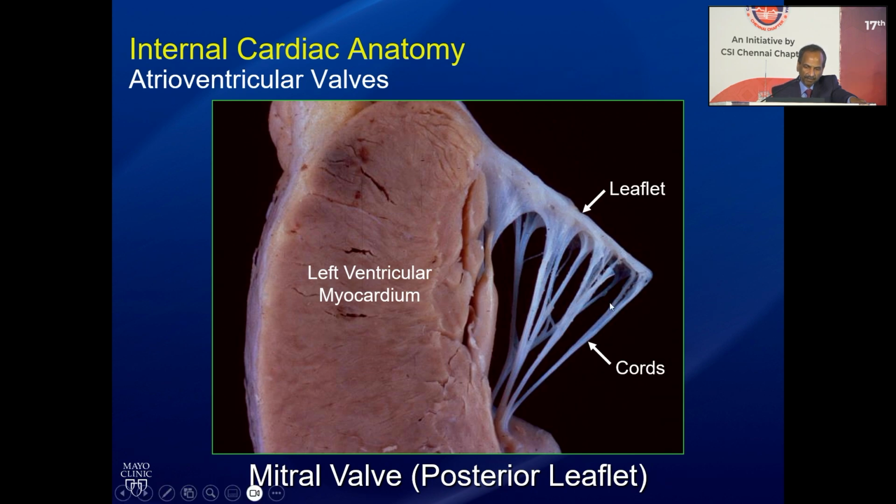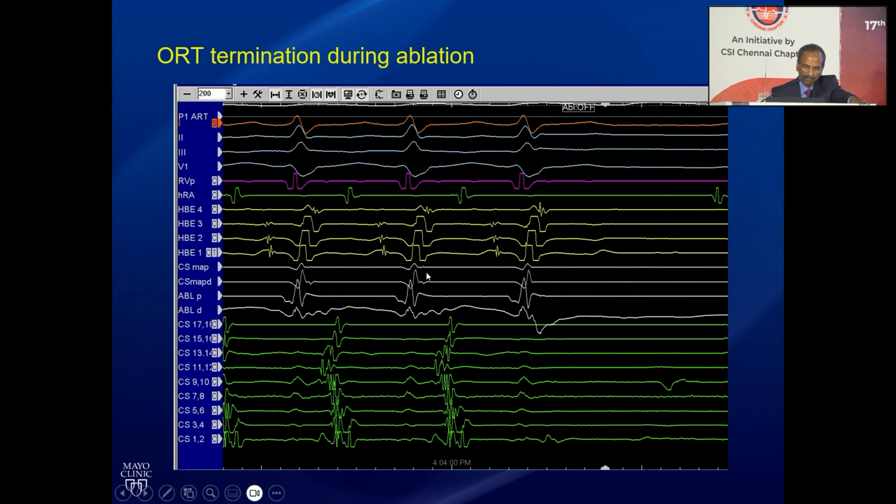When you ablate from underneath the mitral valve, you will never be close to the A. Very important. Your stable location, if this is where the pathway is, you will record big V, you will record pathway potential, but you will not record a big A, very, very small A. If you are getting a good A, you are not underneath the valve. So sometimes when catheter stability is difficult or you're doing retrograde aortic, you want to come underneath the mitral valve, don't expect to see the A. You should have mapped not under the valve and you ablate under the valve, not needing to see the A. This is an example, pathway blocked, hardly any A that we can see in that location.